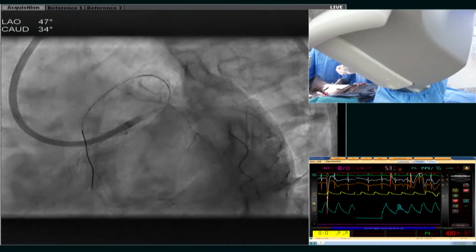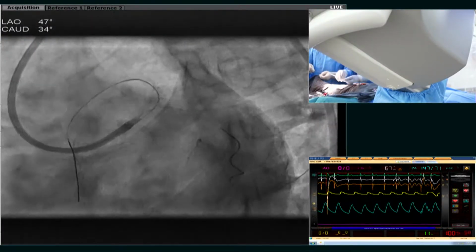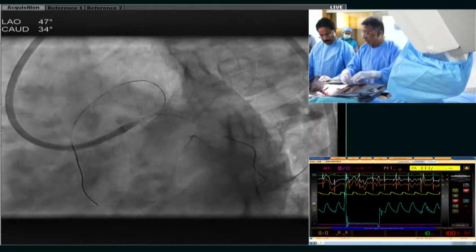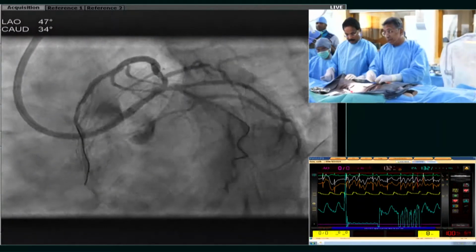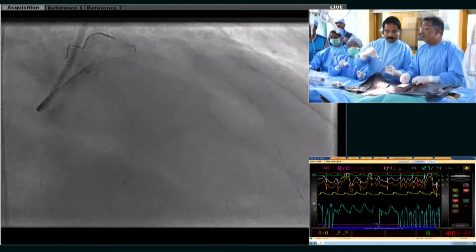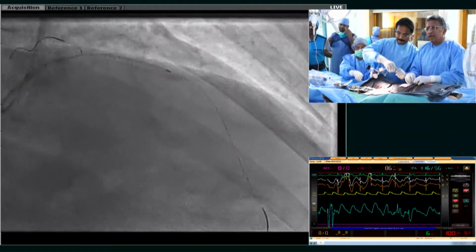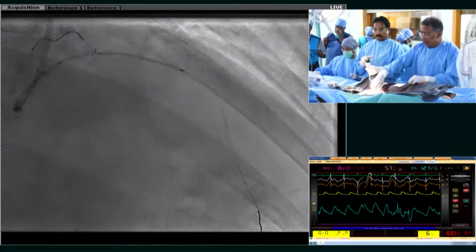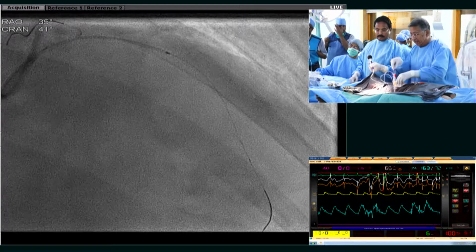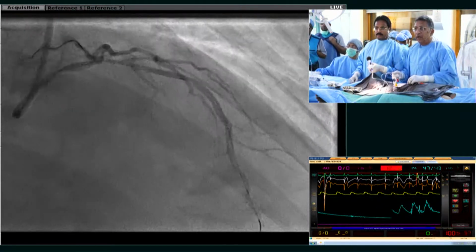What I was alluding to was the fact that if you use a 3 millimeter stent over here, the maximum diameter that stent can be blown up to is only 4.2. That's what the manufacturer recommends. But if you use a 3.5 stent in this particular situation, you can go up to 5.4 millimeters. So in this particular situation, though the distal part of the LAD is only 3.2, I would use a 3.5 millimeter stent, deploy it at not so high pressures, and I'll show you an OCT before we go and do.